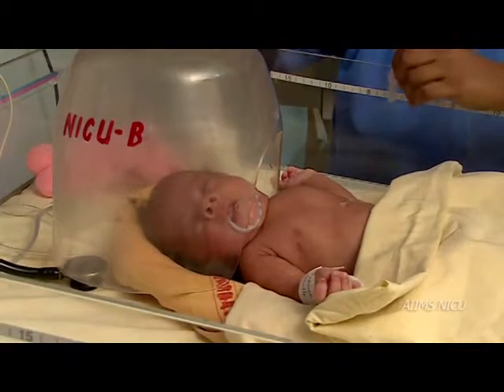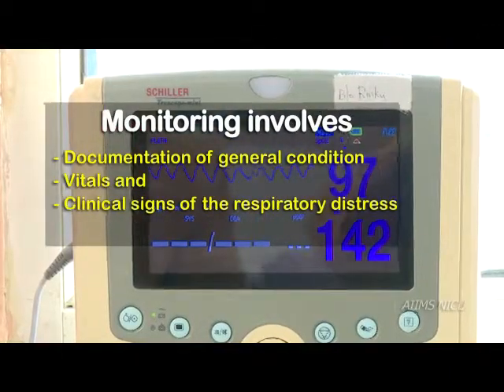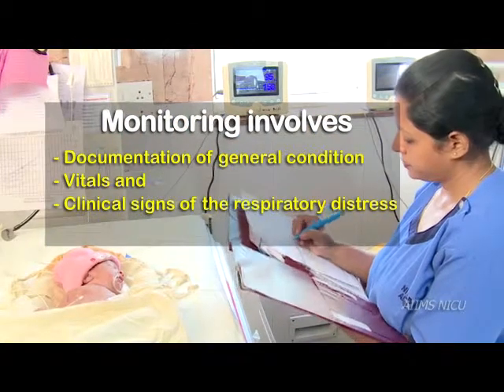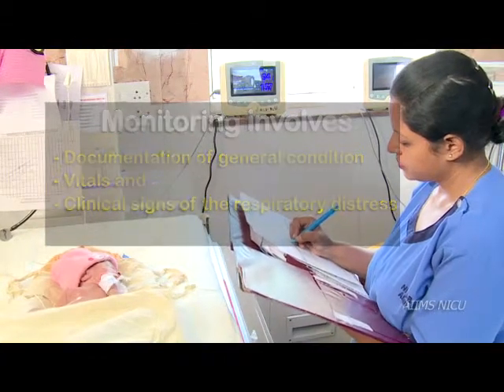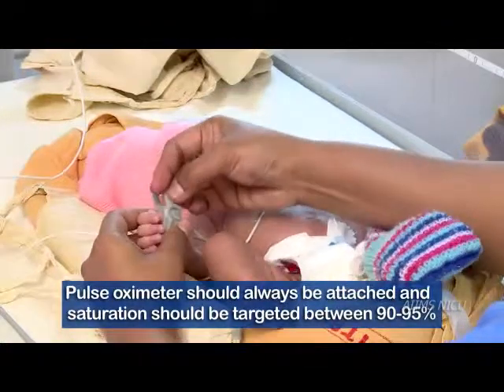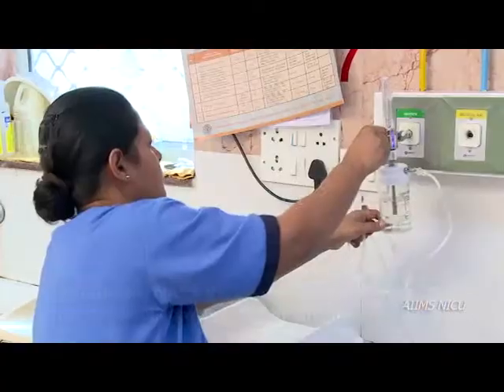In this video, we have learned that one needs to monitor and document the general condition, vitals, and the clinical signs of respiratory distress in a newborn on oxygen therapy. Pulse oximeter should always be attached and saturation should be targeted between 90 to 95%.